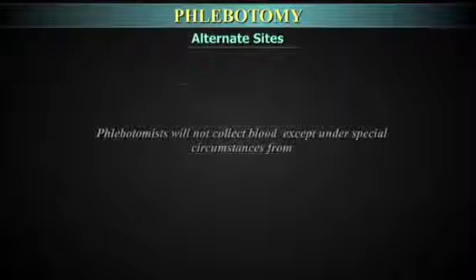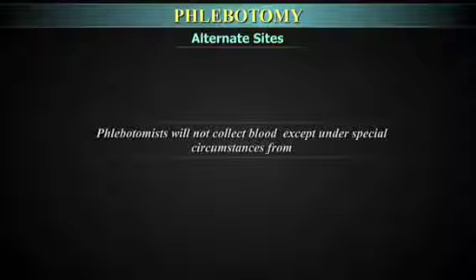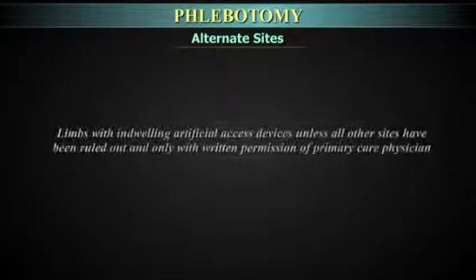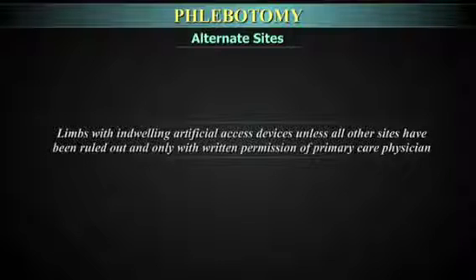Alternate sites. Phlebotomists will not collect blood, except under special circumstances, from the arm or hand on the side of a mastectomy, unless all other sites have been ruled out, and only with written permission from the physician or nurse. Limbs with indwelling artificial access devices, unless all other sites have been ruled out and with written permission of the primary care physician.